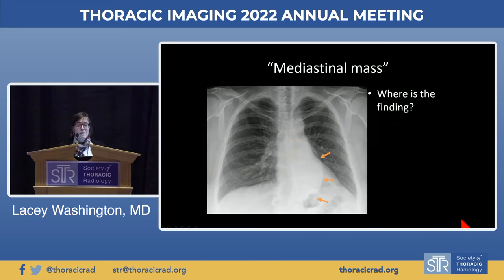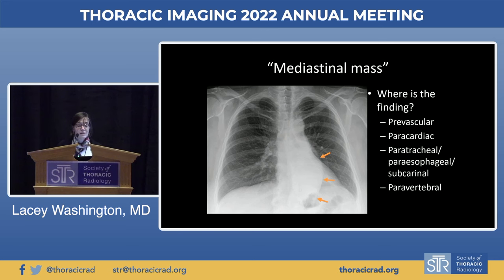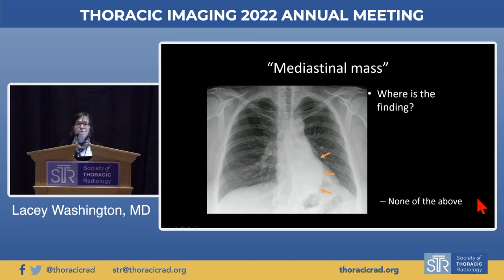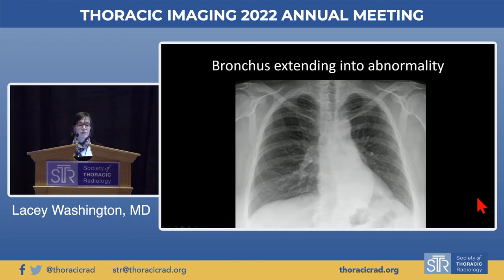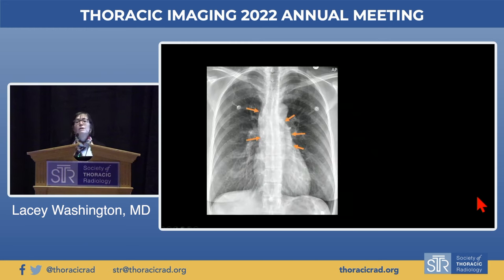Another mass-like opacity you might be tempted to call posterior because it's outlined by air very posteriorly, down behind the dome of the diaphragm. But it doesn't have to be in the mediastinum just because it projects over the mediastinum. If you look carefully, the left main bronchus extends right into this lesion — this is an example of left lower lobe collapse, not a mediastinal mass. Always look at all structures, not just the interfaces.